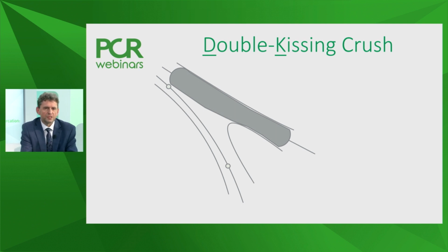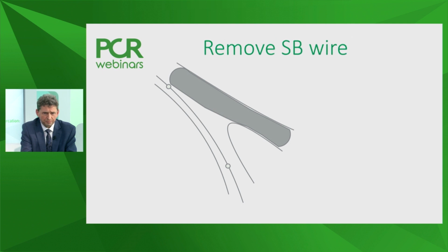So we start with the side branch with the implantation of a drug-eluting stent with some protrusion into the main vessel, as you can see here, after, of course, the proper preparing of lesion, predilatation or rotational atherectomy, as probably in this case. We size, of course, the stents according to the reference of the side branch, with some protrusion into the main vessel.